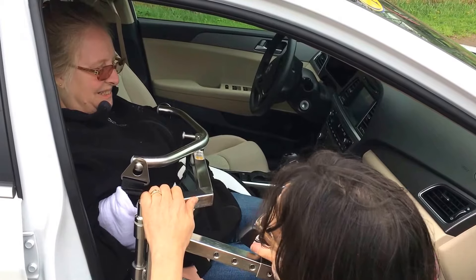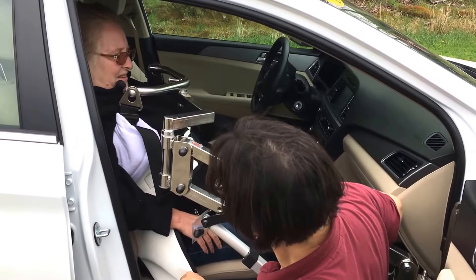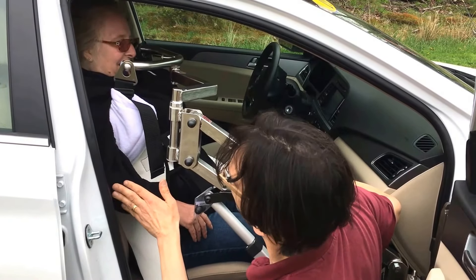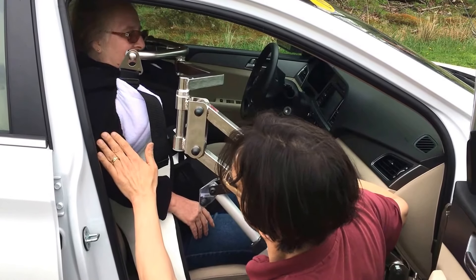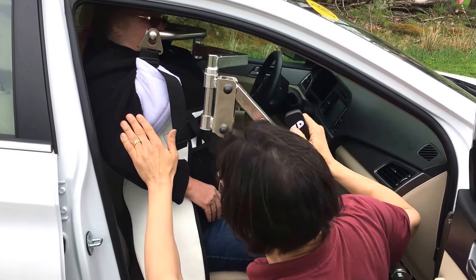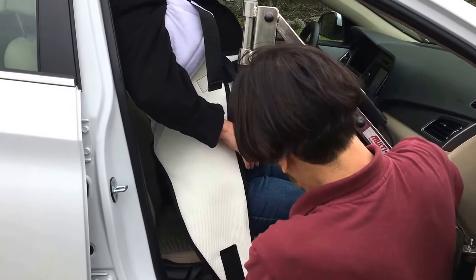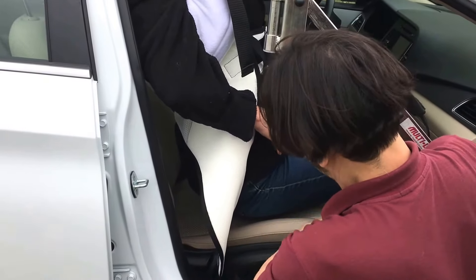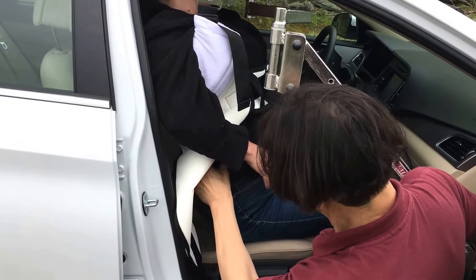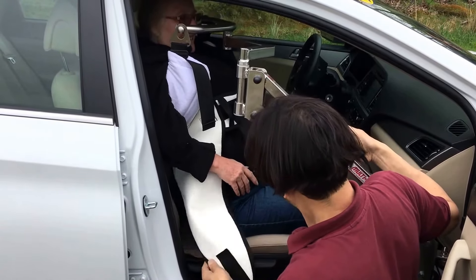Let's watch what happens as we pick the person up. We are creating some pressure under the arms. If the person has no ability to hold their arms down, because they do need to use their muscles a little bit, then this is not going to be an appropriate use of the product. We raise up until we are just touching the head. You'll see we are pretty well up and off the seat — we've got lots of clearance under here, and all the area where we would need to take the pants down is fully accessible. Move the person around, shift them, do as you wish.